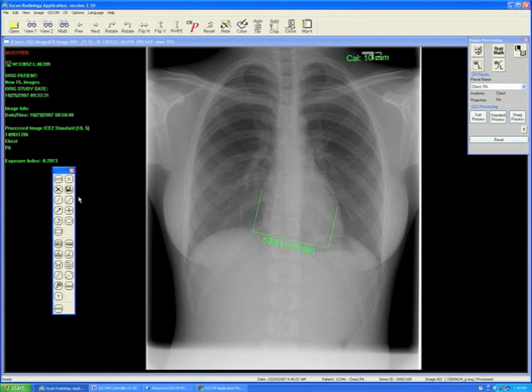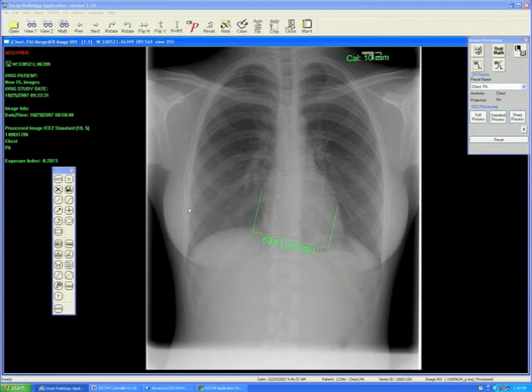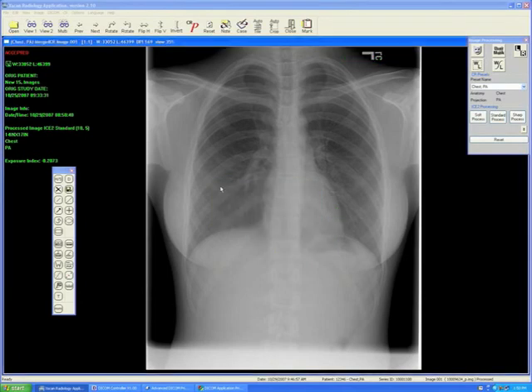Finally, I want to show you the embed button. These annotations and measurements, I'll clear my palette again, are not DICOM tagged. In other words, they will not go with this image when I send it. So, put a couple of annotations in here.